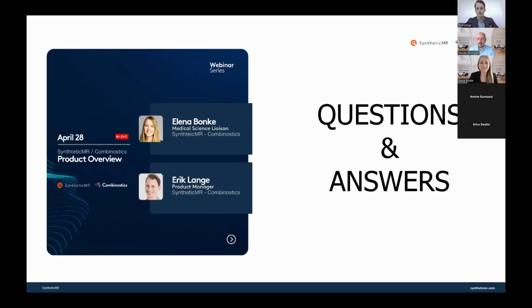Perfect. So thank you both. So just a matter of time. So another question which came in is, I think it goes to you, Elena, most likely, because it came in once you presented the healthy control. So how is the healthy normative comparison database comprised?